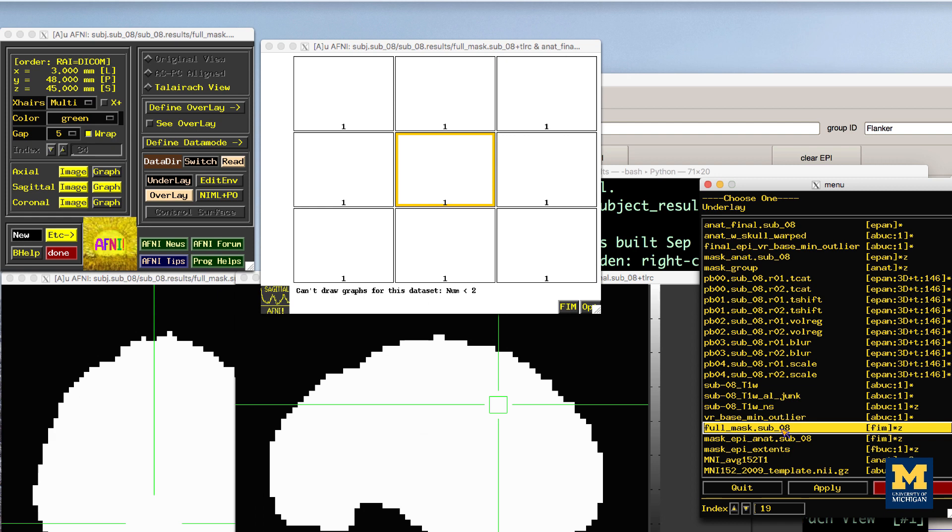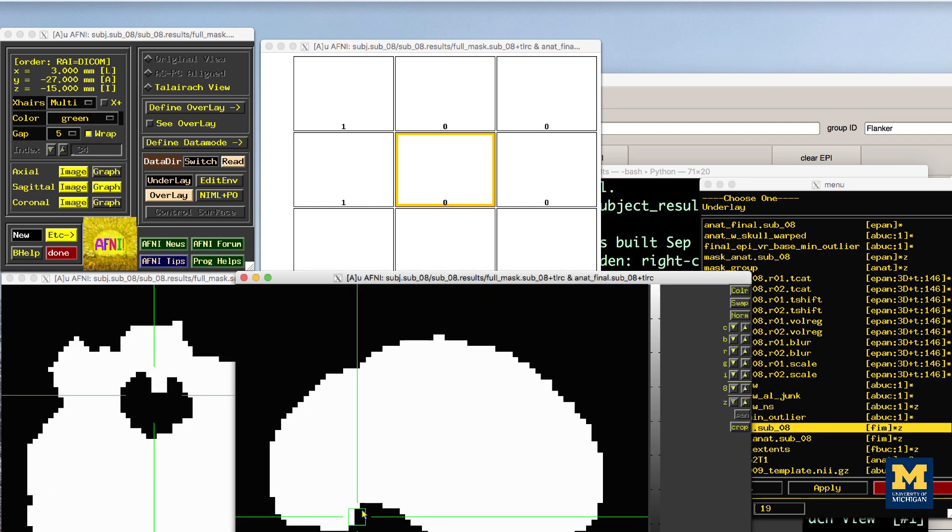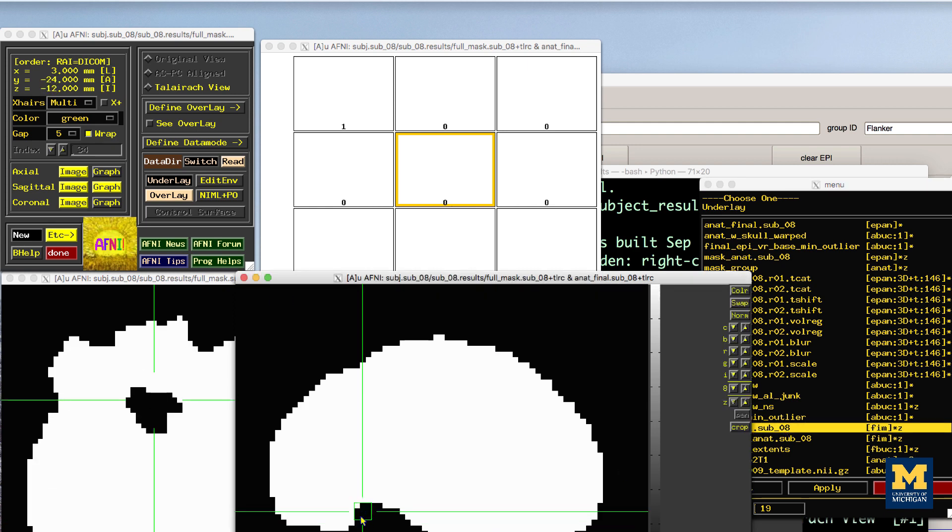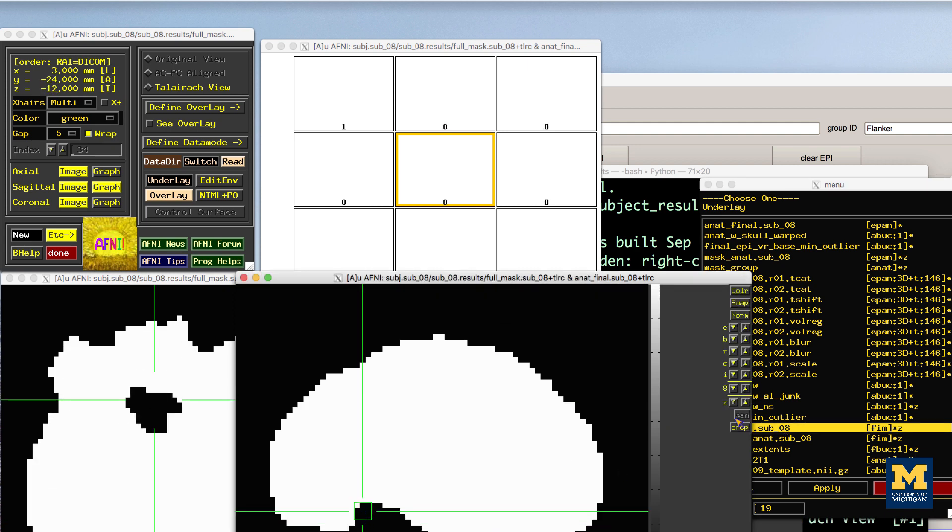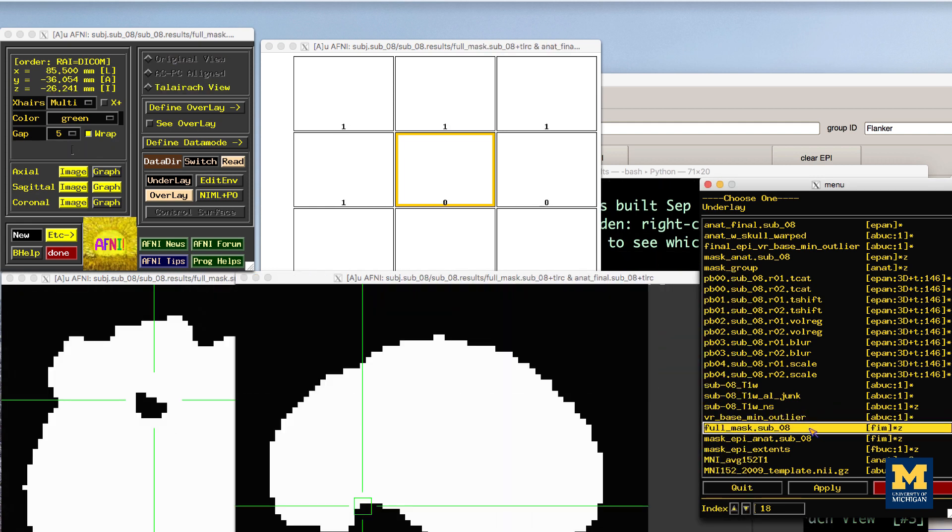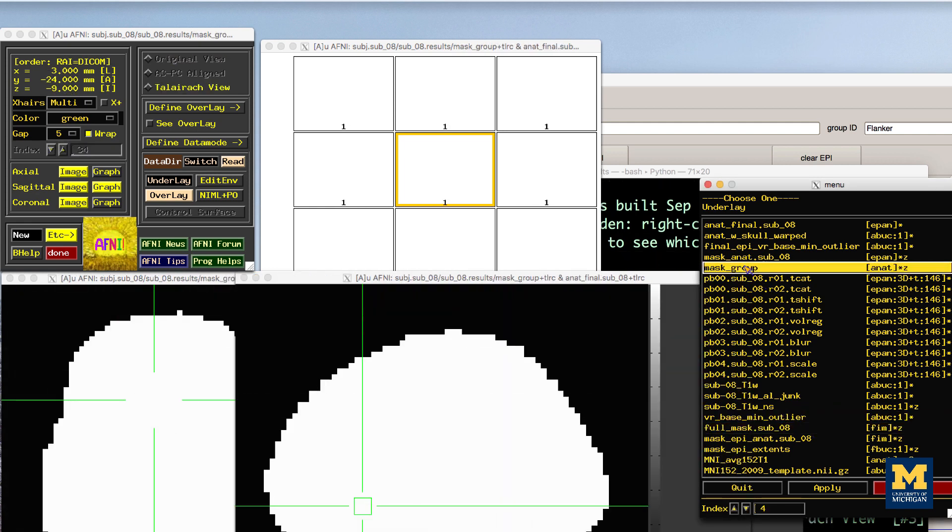The full mask image is a union of all the individual functional image masks. Voxels with very low signal intensity are not considered brain voxels, and in some cases, voxels are excluded in the orbital frontal cortex, which is susceptible to signal dropout. The mask group image is a more generous mask conforming more to the outlines of the template brain. Later on, we can use these masks to restrict our analysis to only brain voxels.